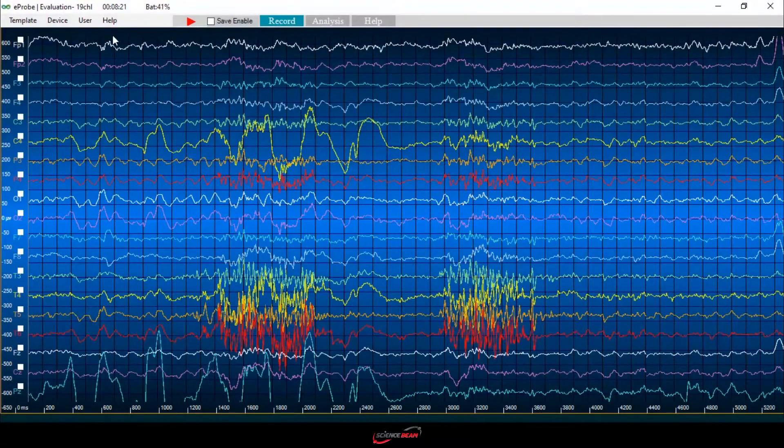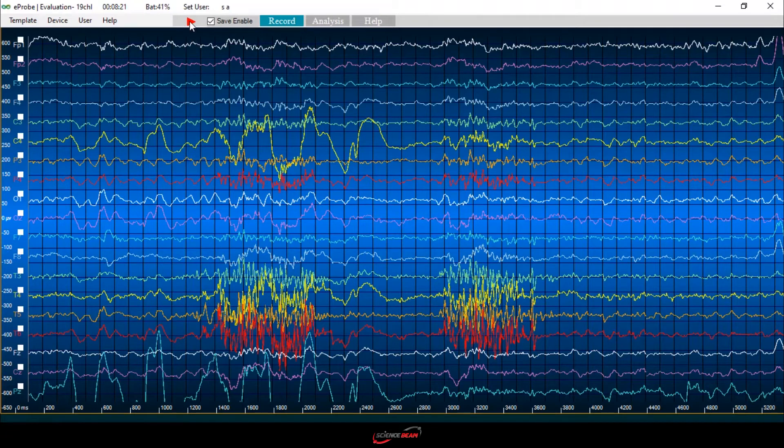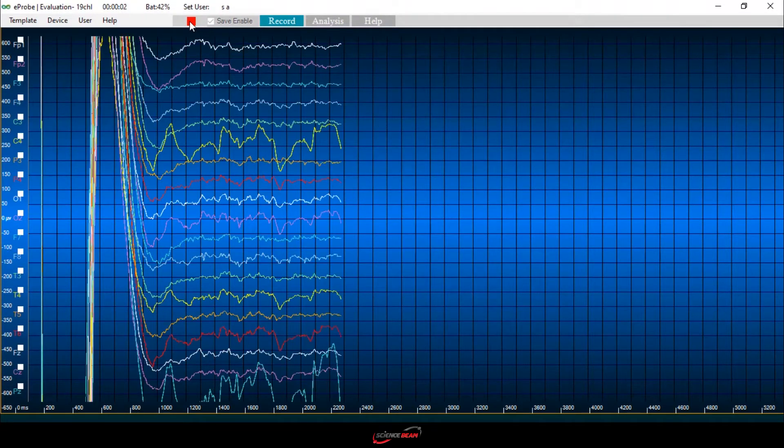Now we are in the eProbe environment that is designed for visualization and analysis of biosignals. From the menu, you can set some parameters including scale, time division, and low-pass and high-pass filters. As you can see, we have clear and noise-free signals from 19 channels.